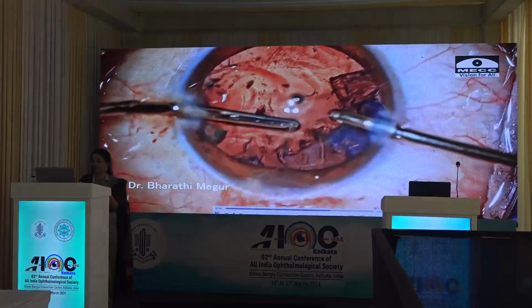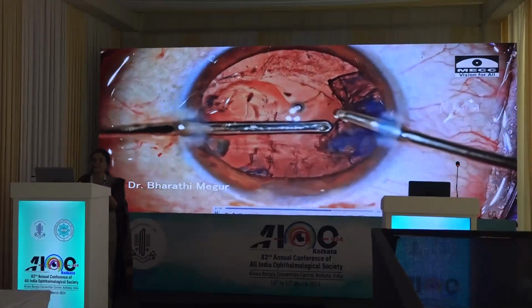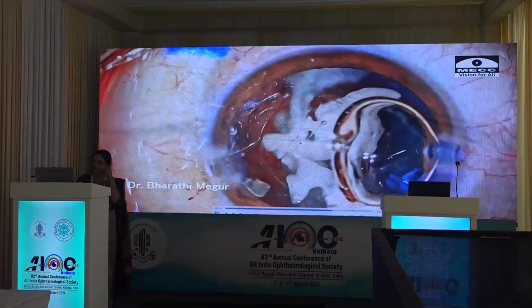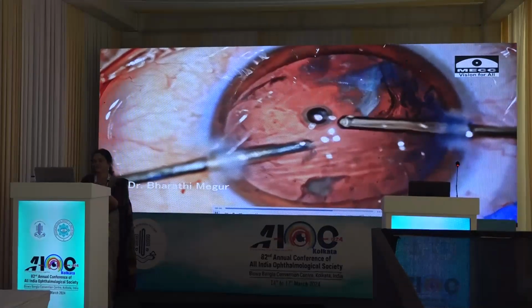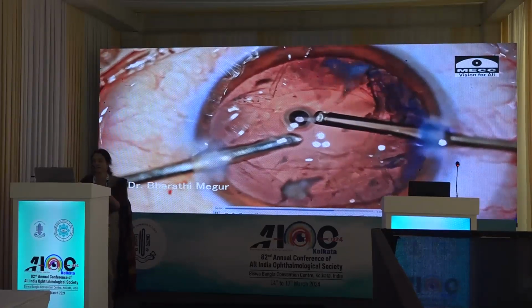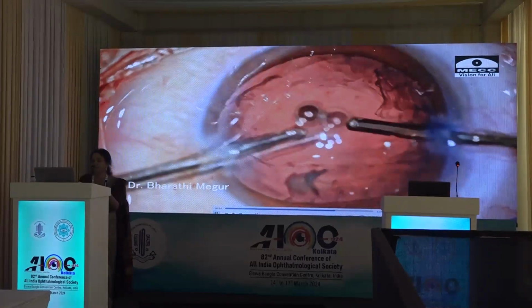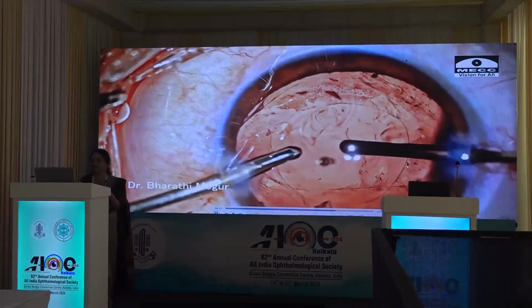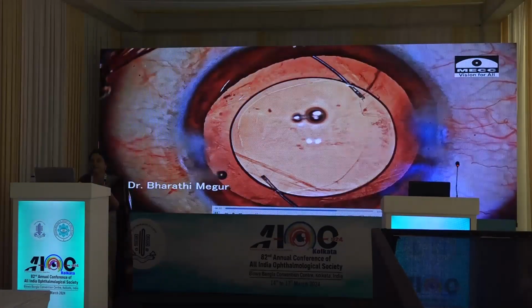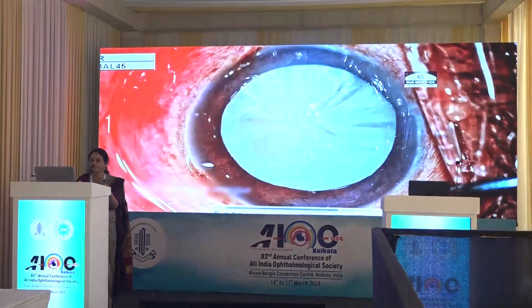So I noticed at the very last stage of cortex removal that there is probably disturbance of the vitreous. I used triamcinolone acetonide again here with the diluted 1:4 concentration. I identify that the vitreous is disturbed. It is a tad bit difficult to identify vitreous disturbance when you have used excess viscoelastics, but with a little bit of clinical surgical experience it is easier to identify, and as such triamcinolone acetonide is a great tool to identify vitreous disturbance. That was the final picture after the IOL implantation.